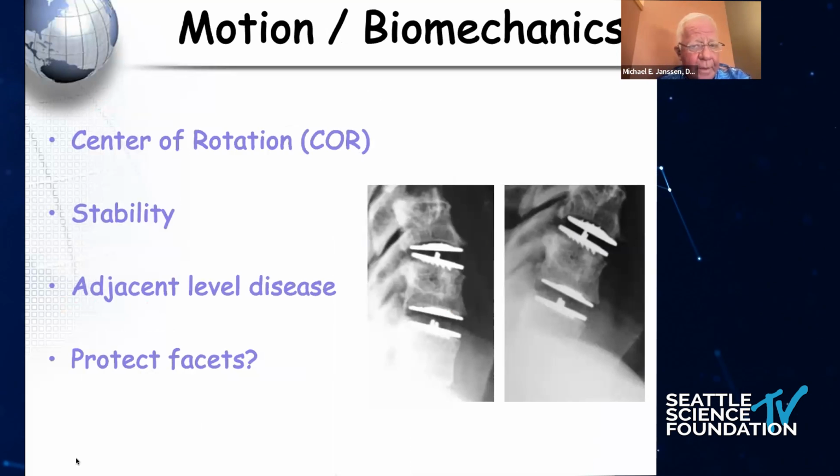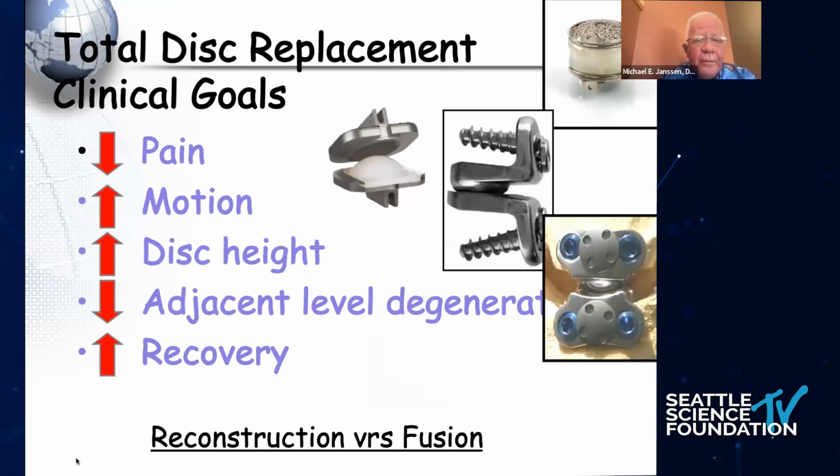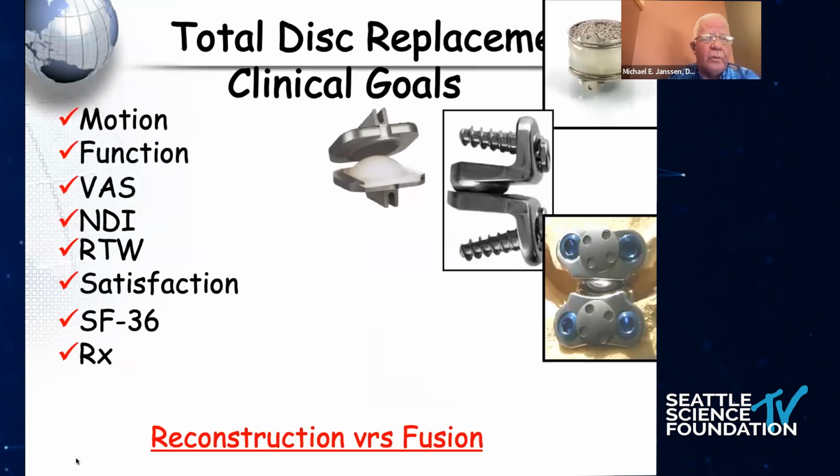The key I worry about with these implants is I never really saw good bony ingrowth on the left X-ray, the top superior plate. And so you worry about whether that's really got good ingrowth, and is that really moving, and is it a good match with the facet joint. But the goals of all of these types of implants are the same as we have for ACDF. It's to decrease the pain, increase the motion, increase the disc space height. Let's talk about adjacent level disease. And does it have a quicker, faster recovery than we normally see with an ACDF? And I think it does. Again, I tend to restrict these patients for a small time.